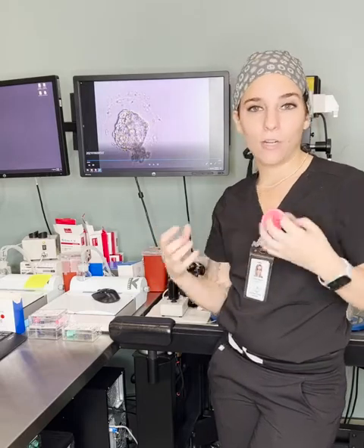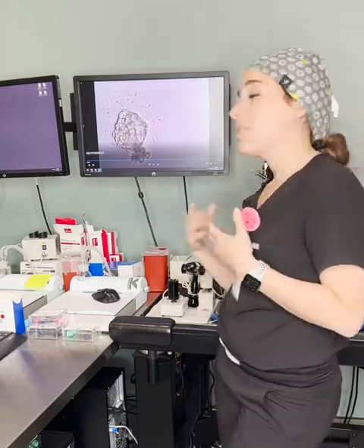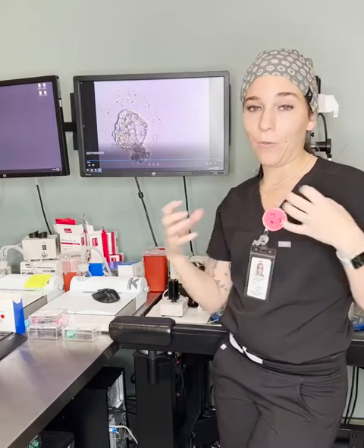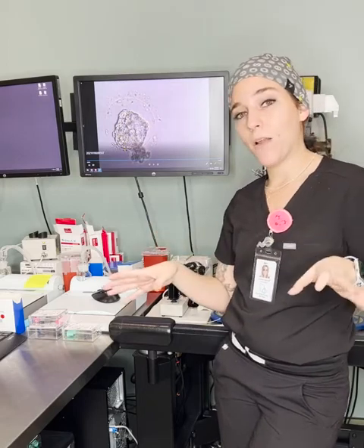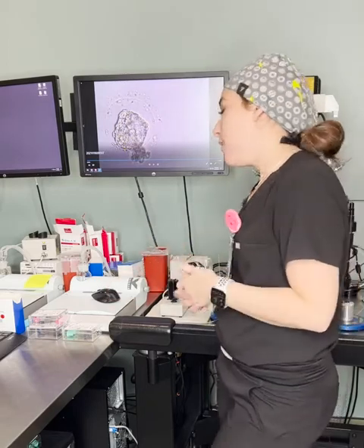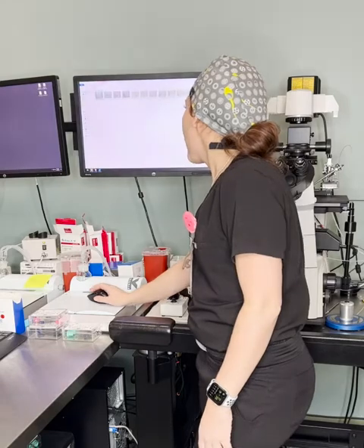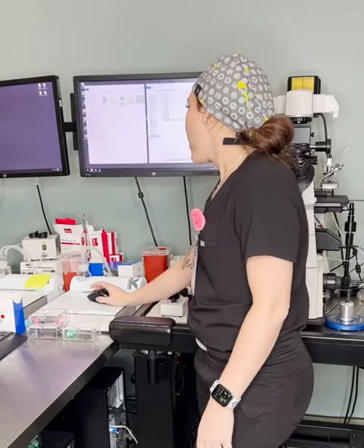Usually it ends up pulling out of 1 hole anyway, but you see it starting to hatch out of 2 holes. This is another reason why it's a controversial issue. Some people think that it has the ability to pull that embryo apart as it's hatching if it's in 2 different spots and then create monozygotic twins. Again, very rare occurrence, but again, controversial issue. So that's pretty much it for assisted hatching.